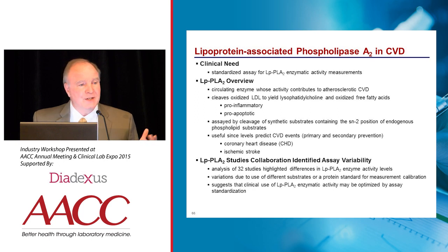The beauty of that is all of our chemistry analyzers are designed to measure activity. We've got a nitrophenol substrate here. We know the molar absorptivity. We could even run the assay without a calibrator, just use Beer's law to calculate the result. So we're pretty excited about being able to do the assay.